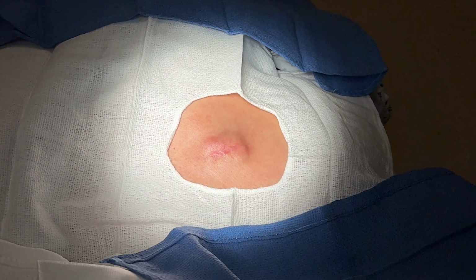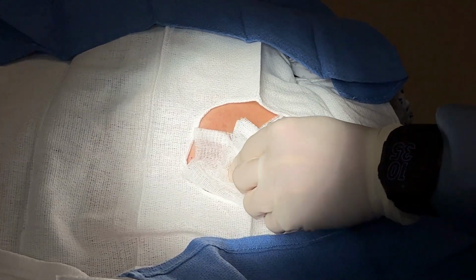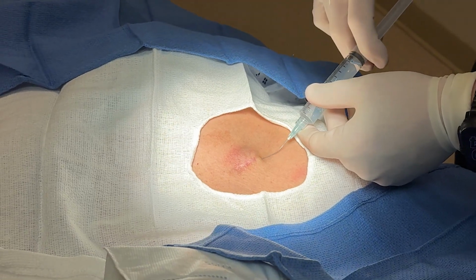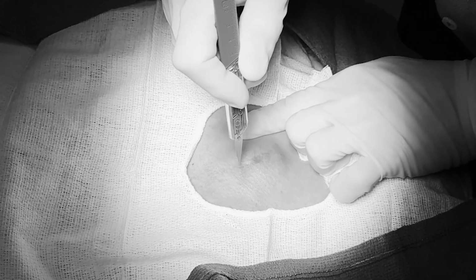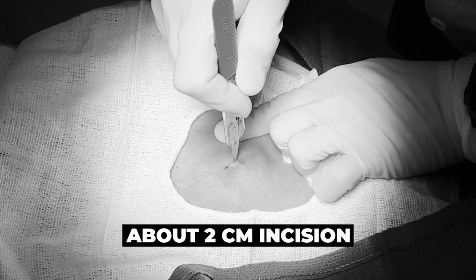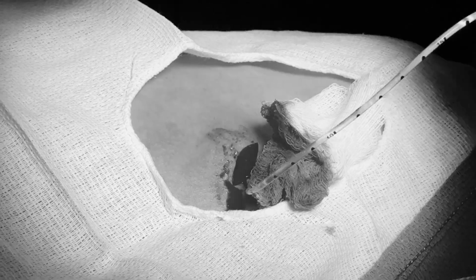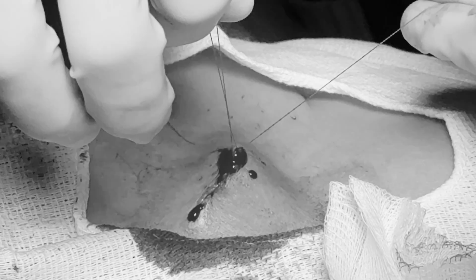The procedure is really quick and typically takes me only about 10 minutes to do. Not even that. During the procedure, we obviously clean the area carefully and then we inject lidocaine to numb the area. The lidocaine may burn and sting for a little bit, but you know the drill. It'll go away and everything will be numb. We then make about a 2 centimeter incision, a little bit smaller than an inch, and we dissect the Mediport and gently remove it. We then close the incision again with absorbable sutures that will dissolve by themselves, so you don't need to come back to remove the sutures. Again, it's all very simple.